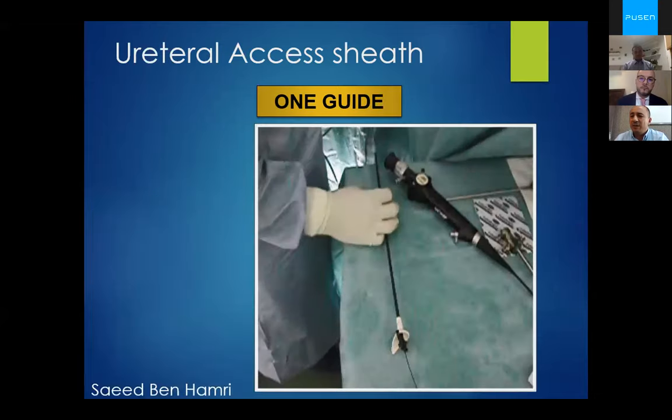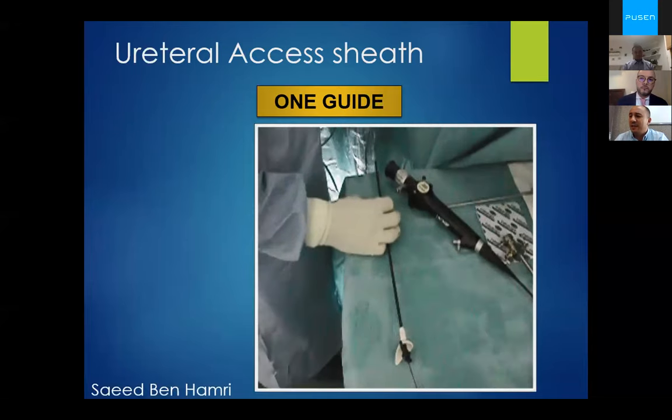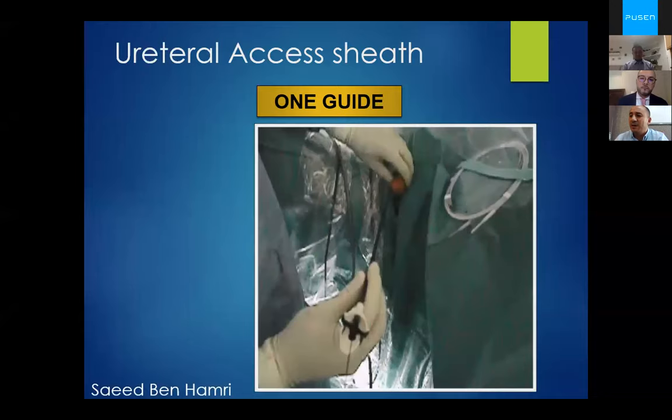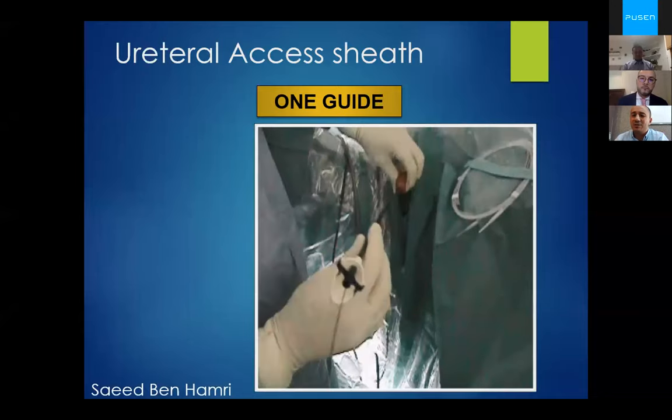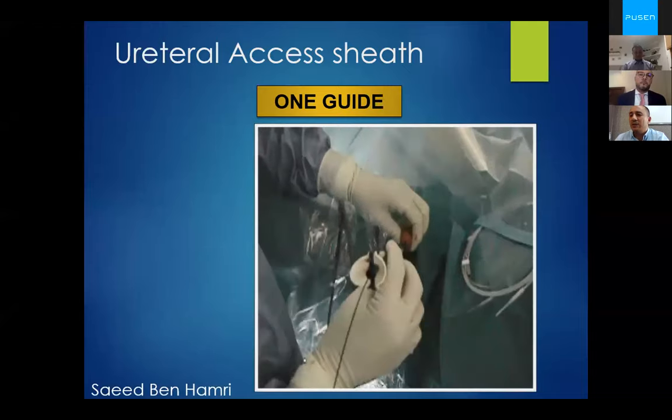The inconvenience of this type, as shown in this video of Dr. Saeed, is that we must introduce the safety guide before, so we must use the cystoscope twice to introduce two guide wires before.